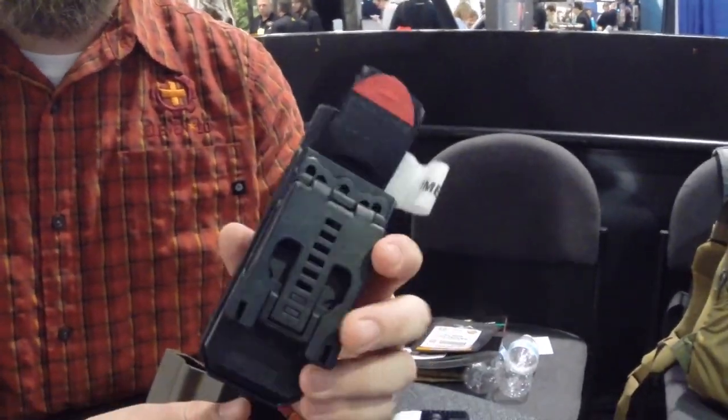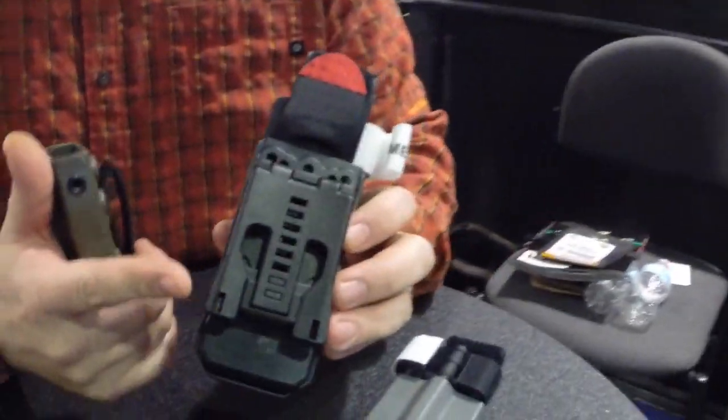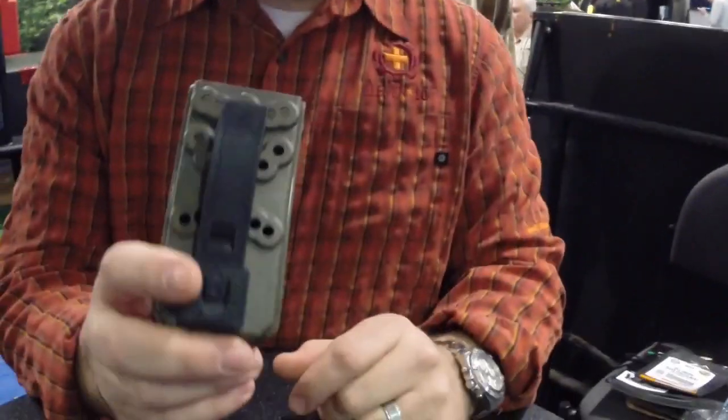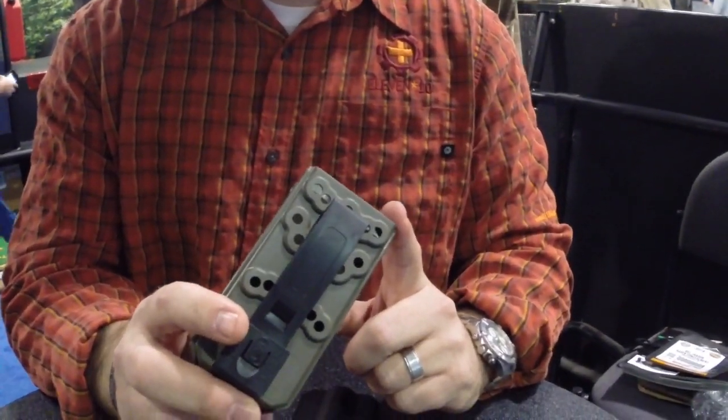The mounting options available are the Blade Tech Tech-Lock, which will fit a law enforcement duty belt — two and a quarter inch. We also have the Malice clip for MOLLE attachment.